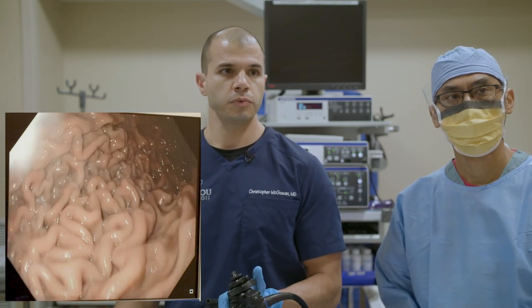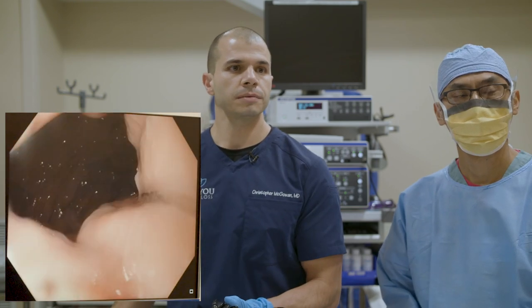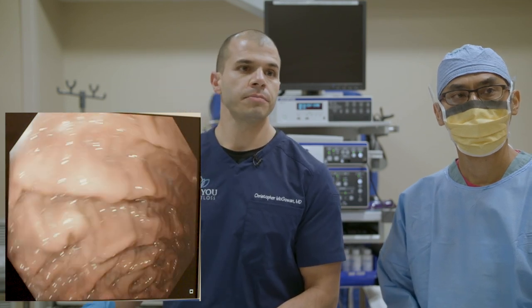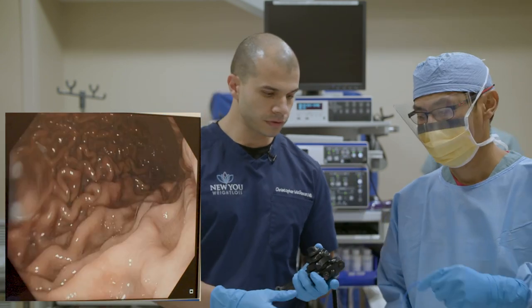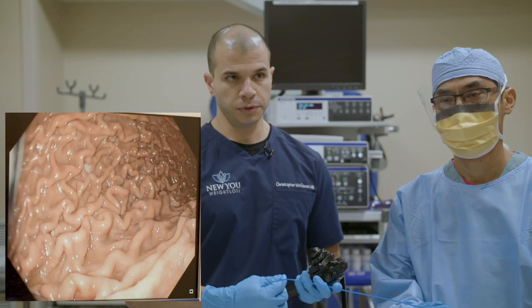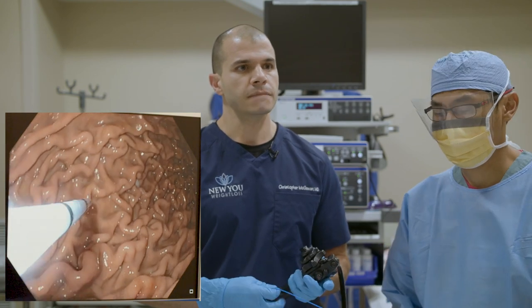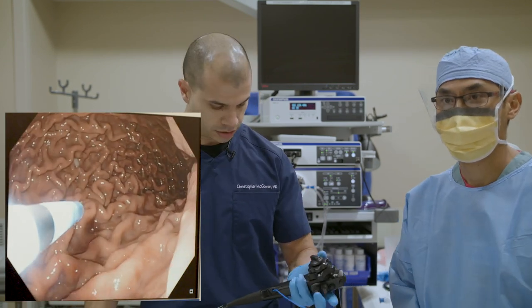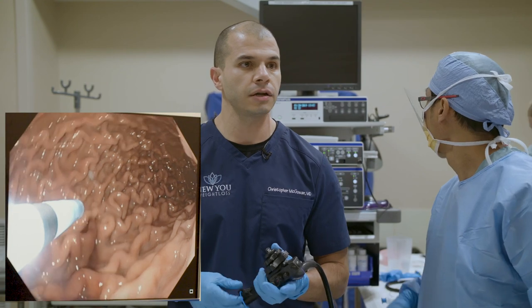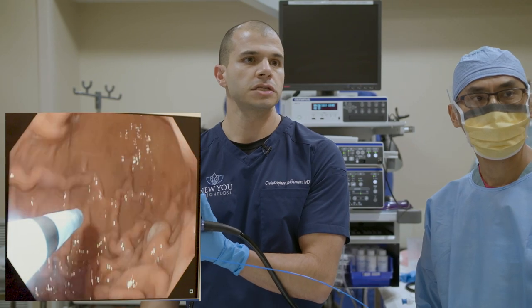We're down in the stomach now, looking at a normal healthy stomach, and we're going to fill it up with gas to inflate it. Her stomach is pretty normal — about 35 centimeters in length, which is average. The first step is to mark the stomach so we know where to go during the procedure. We're using a technique called argon plasma coagulation — this catheter shoots out argon gas, which sparks and causes a small burn to mark the stomach.